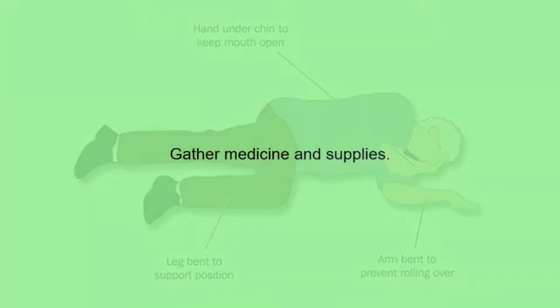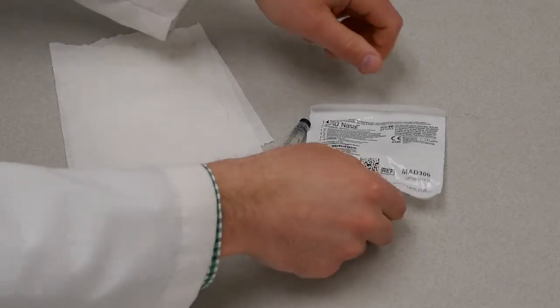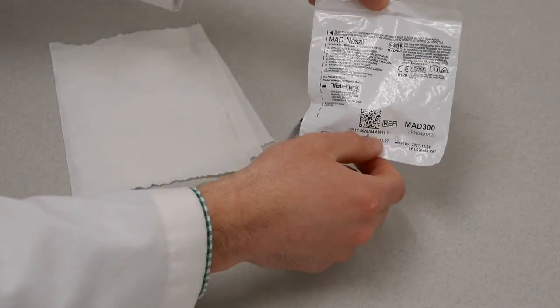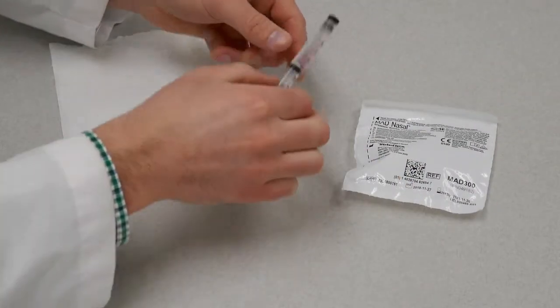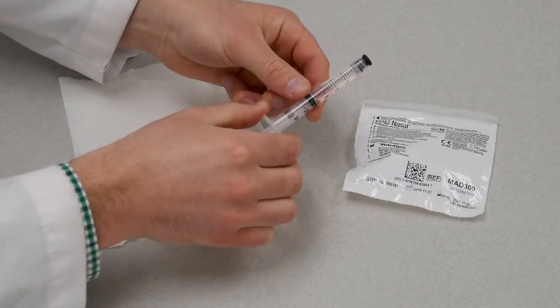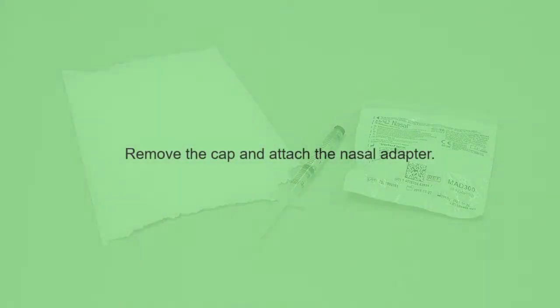Gather the syringe with medicine and the nasal atomizer, or cone-shaped nasal adapter. Remove the cap from the syringe, and connect the nasal adapter to the syringe by twisting it into place.